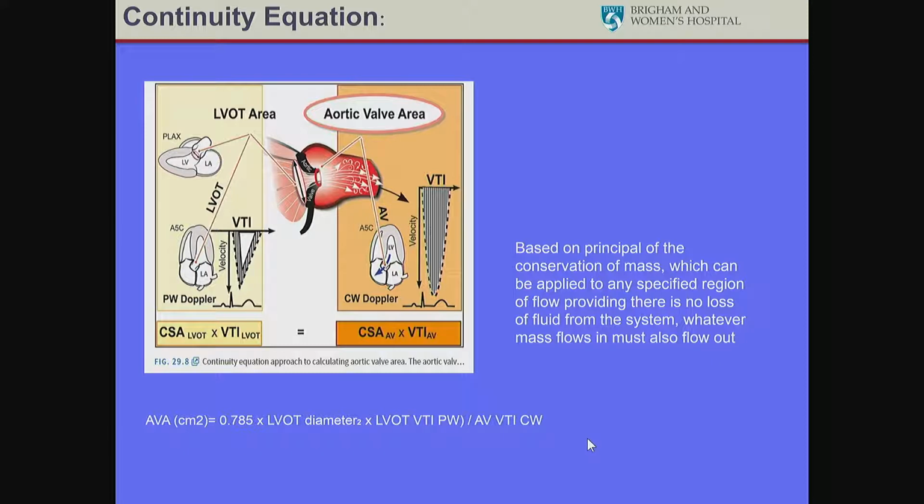So make sure you know this equation and make sure you know how to calculate a patient's aortic valve area if given this data.